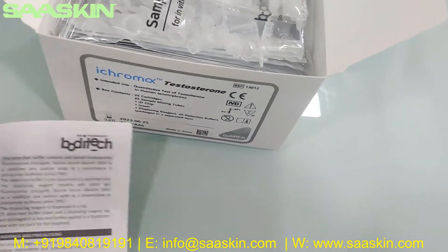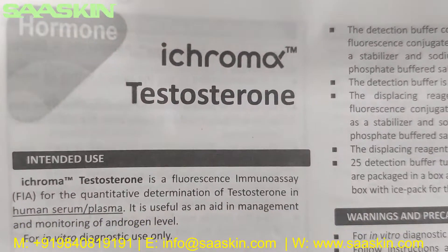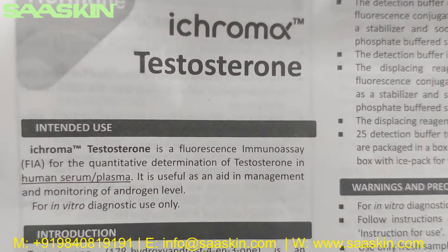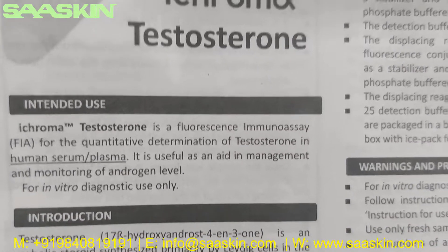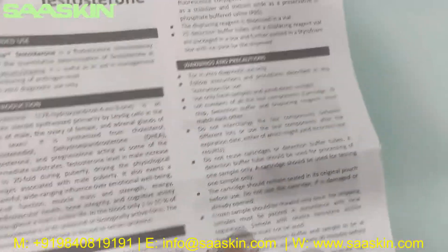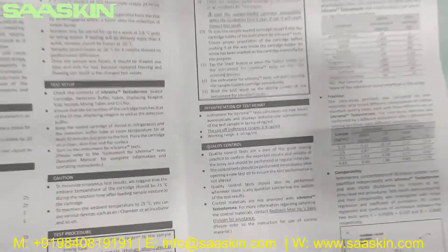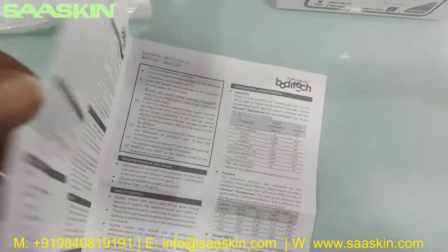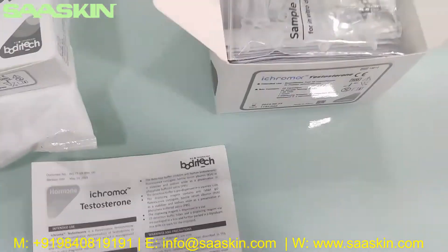Inside you can see there is one brochure, and it says i-chroma Testosterone. It's a fluorescence immunoassay for the quantitative determination of testosterone in human serum and plasma. You get the complete instructions — the introduction, product principle, components, warnings and limitations, how to set up the test, how to run the test, how to interpret the results, and the quality control parameters.